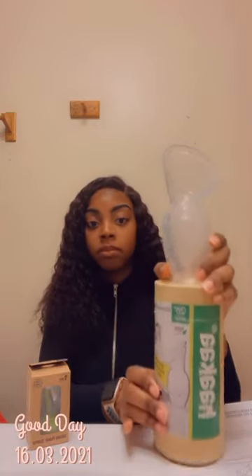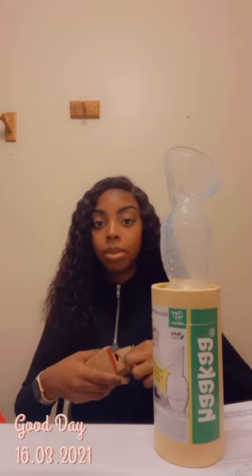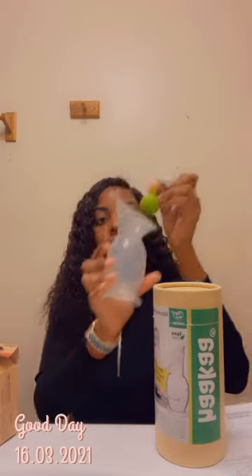It comes in this packaging, and inside it comes with this little flower stopper that goes right in here like that.